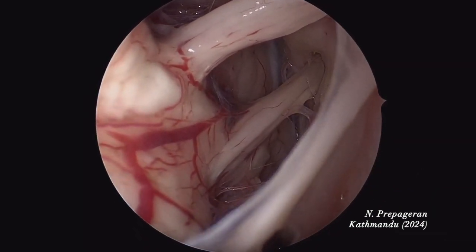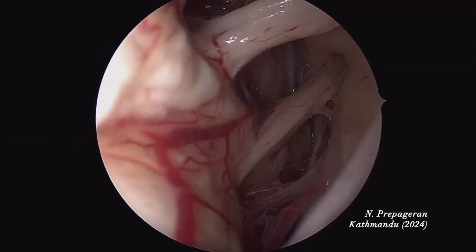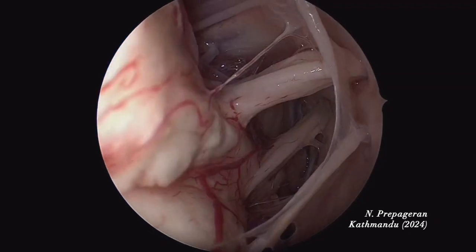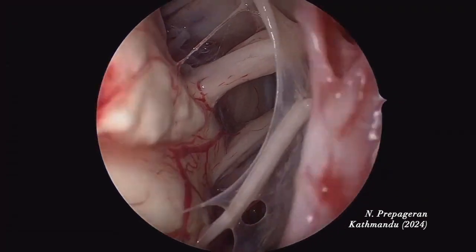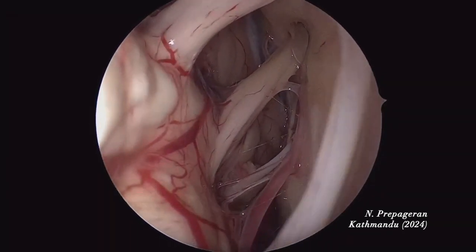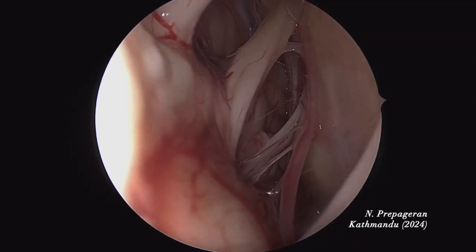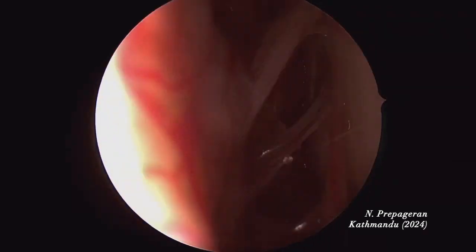Down there is nine and ten. So that's seven and eight, nine and ten. This is five. IAM below here at four o'clock — that's nine and ten. Multiple rootlets of eleven going to the jugular foramen. So here is the paraclival carotid. This is the carotid artery coming from the paraclival — vertical portion. Horizontal portion will be behind this in the petrous apex. Paraclival carotid coming up, it forms the carotid siphon as well as the cavernous portion. This is the cavernous portion of the ICA.